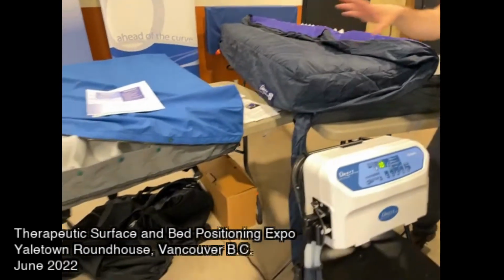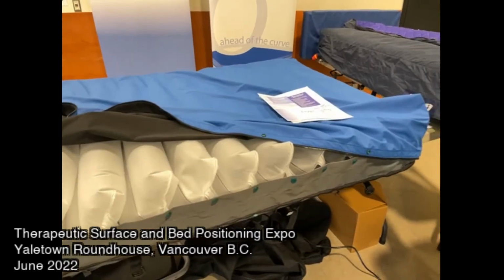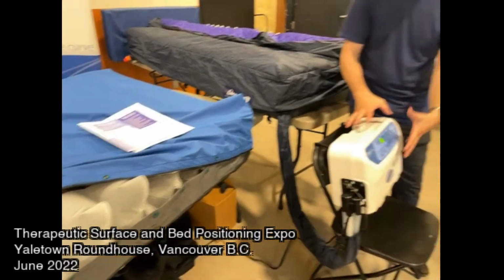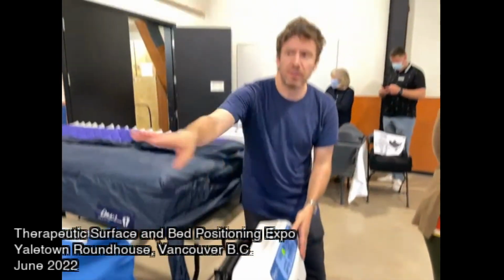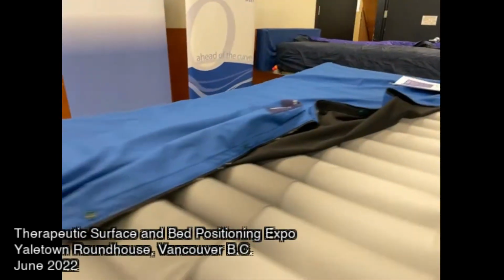So this is classified as a micro low air loss. It's the same system, very similar. This is using a blower to generate that higher airflow rate, and this is more like a compressor. Oh, okay.